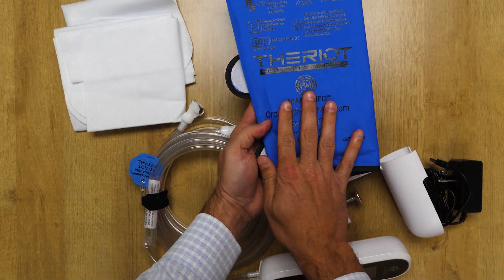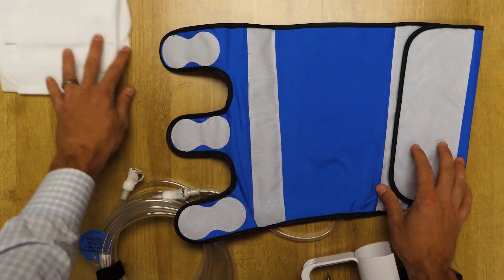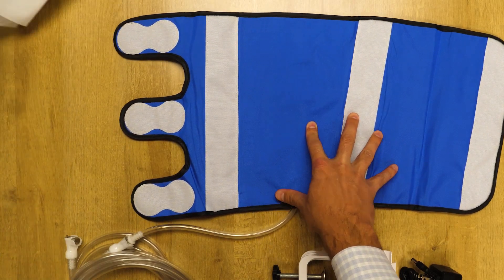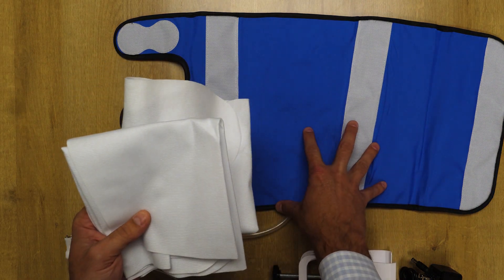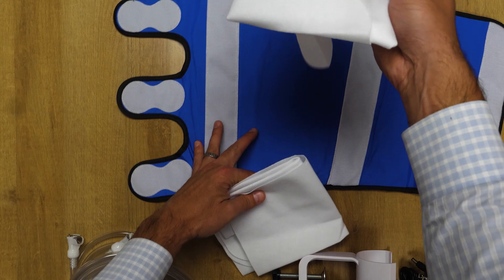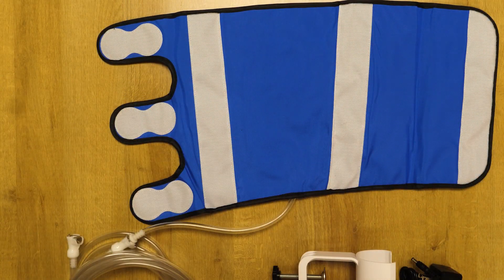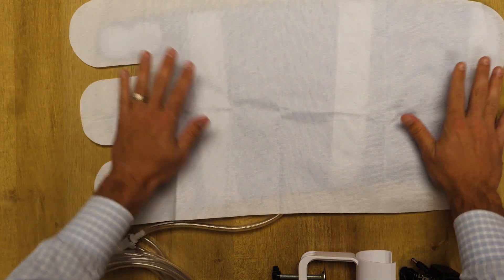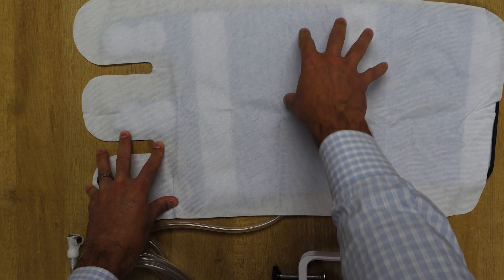If we were going to show you how to apply the reusable sleeve in the surgery center, you would lay it out like this. The part number is M31. You would then grab a box of barrier sleeves. Then you would lay out the barrier sleeve on top of the reusable sleeve to safely provide a barrier between the patient's skin and the reusable sleeve.